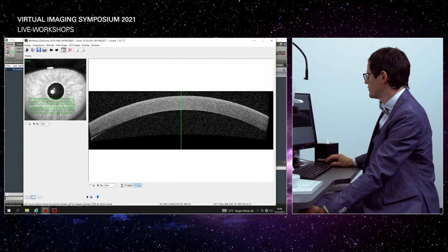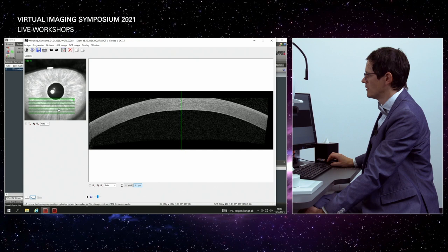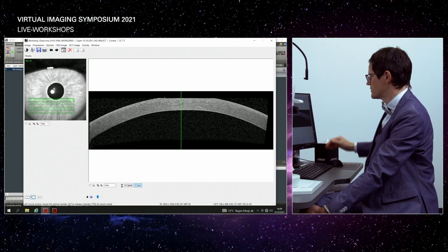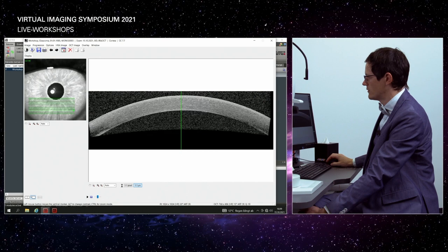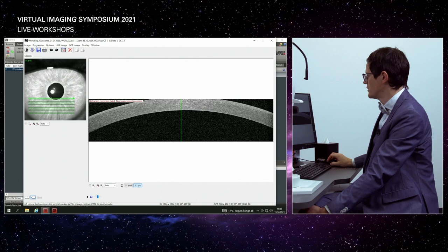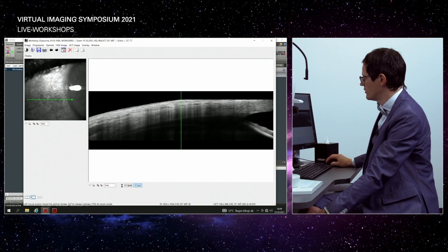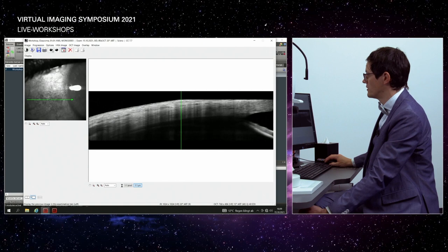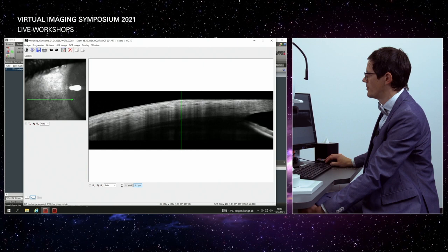The volume scan has less image detail, which again is the reason I recommend using the line scan. The closer to the center, the better the quality; the further from center, the lower the quality. Looking at the sclera scan: you can see very high-quality images of the sclera and surrounding structures. The high quality of the spectral domain OCT is quite unique compared to swept-source OCT. The iris structure is also clearly visible.